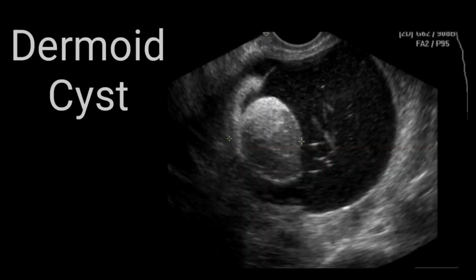This is a transvaginal scan, and on this scan you can see a complex cystic lesion which is called a dermoid cyst. The wall of the cyst is smooth, regular, but within the cystic parenchyma you can see low level internal echoes and thin septation as well. Beside this there is an echogenic nodule. So this is actually the dermoid cyst.